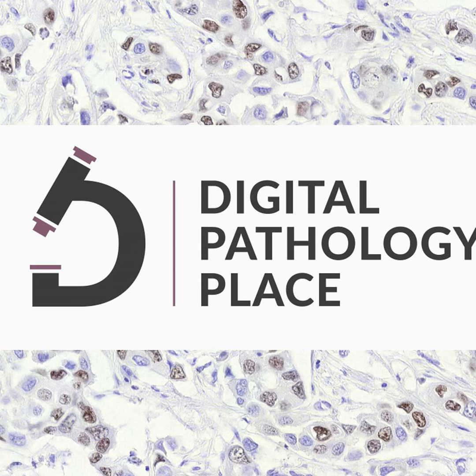task. In 2003, FDA granted clearance to the first algorithms for quantitative image analysis of IHC markers. Estrogen receptor, ER, quantification tool by Cell Analysis and human epidermal growth factor receptor 2, HER2, quantification tool by Clarient received clearance, marking the entry into the market as medical devices.